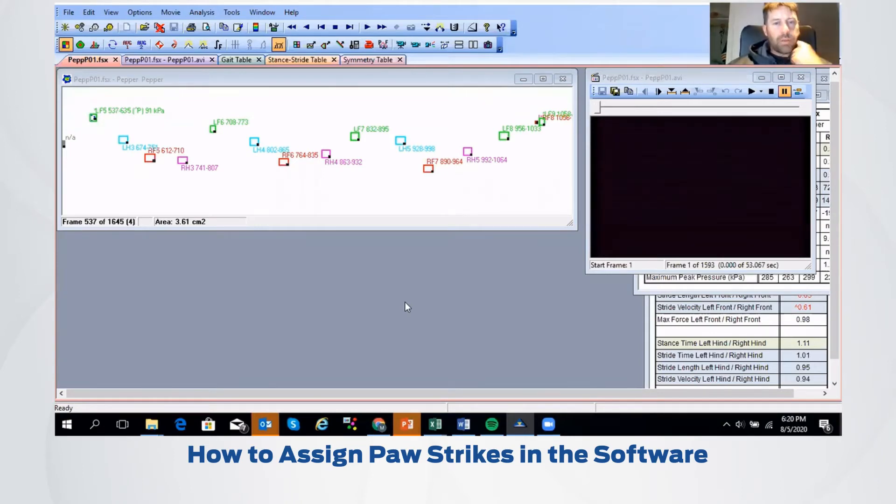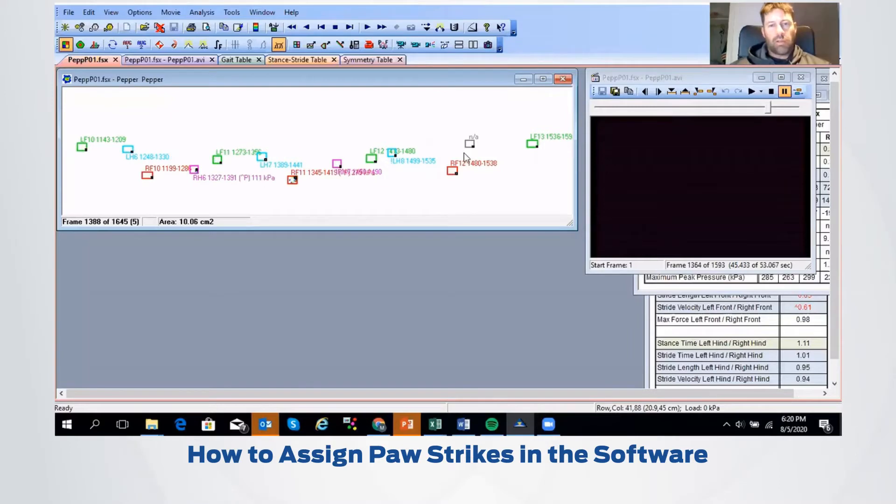We're now going to take a look at the data that we collected with Pepper. The first screen we're seeing here is essentially the walkway, and we've got our video that we were collecting at the same time. I'm just going to go ahead and play this forward. We can see the synchronized video — the foot strikes are coming up here. You'll notice green boxes depicting the left front, blue is the left hind, red is the right front, and purple is the right hind foot.